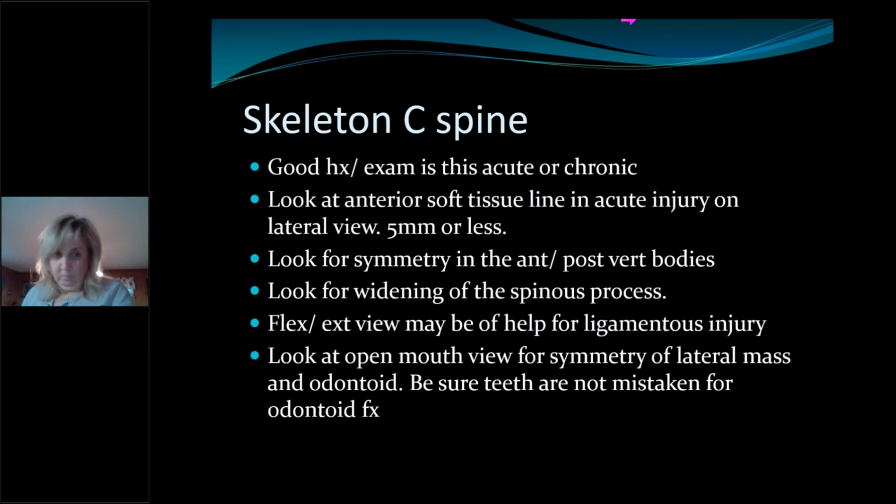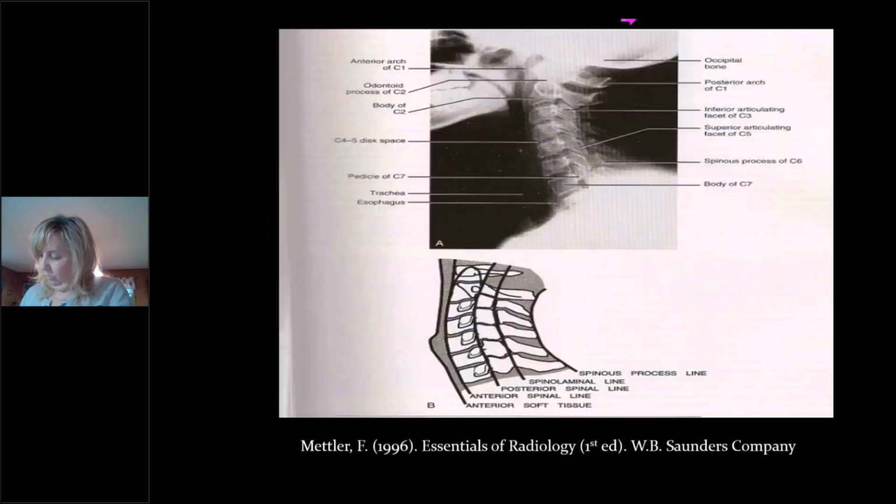So another place to think about those odontoid views is in rheumatology patients. Folks with RA will get erosive changes of the odontoid, and they can lead to significant instability, degeneratively speaking. So if you got a patient with rheumatoid arthritis, it behooves you to get the AP, lateral, and open mouth view to evaluate that odontoid and make sure there's not any significant abnormalities because of the degenerative rheumatological process.